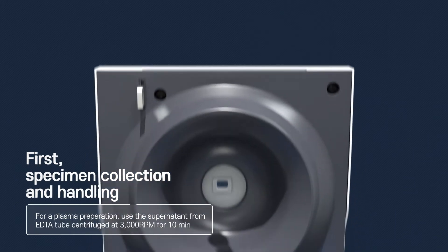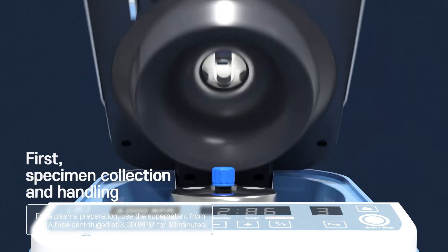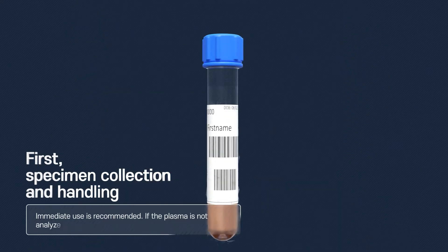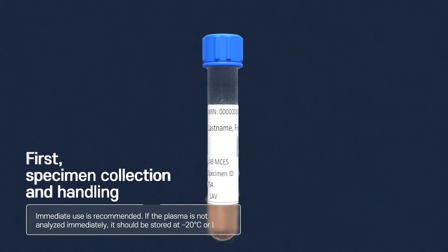For plasma preparation, use the supernatant from an EDTA tube centrifuged at 3000 RPM for 10 minutes. Immediate use is recommended. If the plasma is not analyzed immediately, it should be stored at minus 20 degrees Celsius or lower.